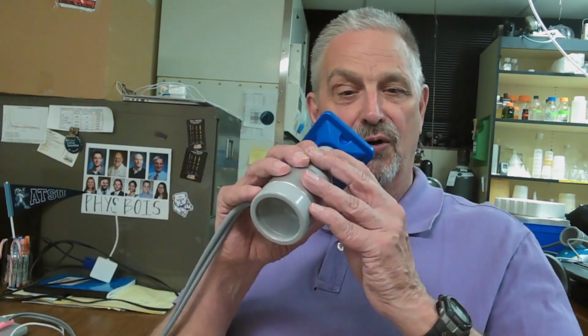Typically the respiratory tech is going to say blow, blow, blow, push, push, push, keep going, keep going, encouraging the patient for the entire 6 seconds. This will help immensely for a patient to keep their effort.